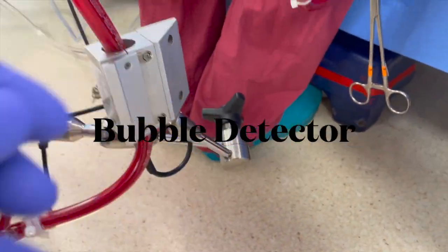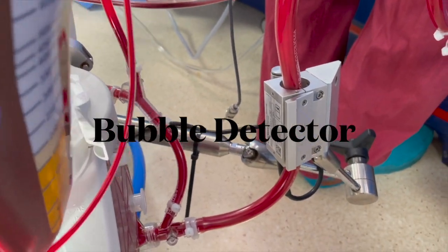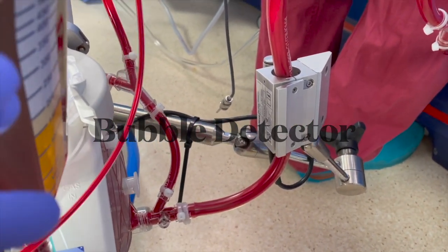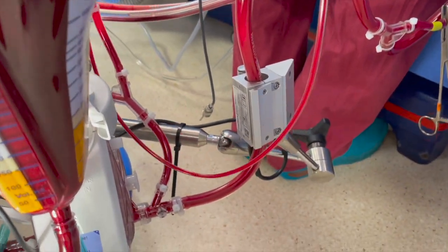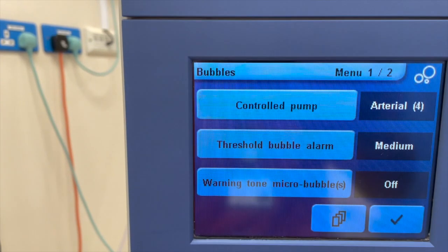Bubble detectors are key to patient safety. They are required to be clamped on the arterial line right after the arterial filter to protect against massive air embolism. The bubble detector automatically warns and stops the arterial pump.